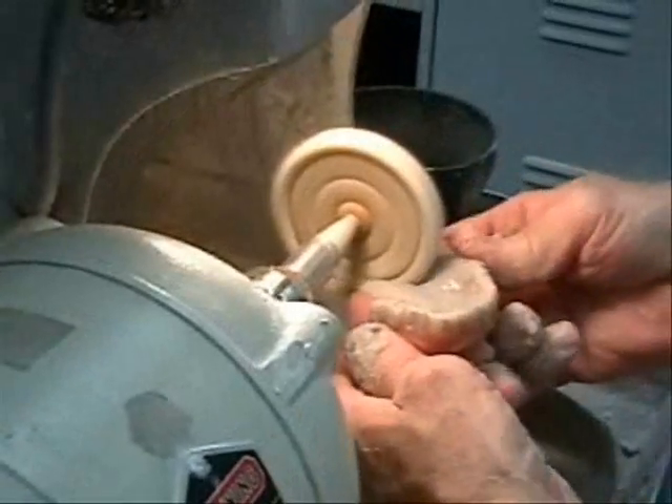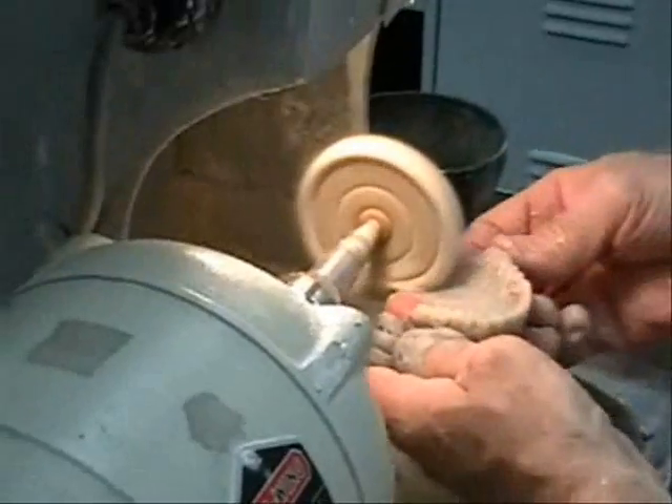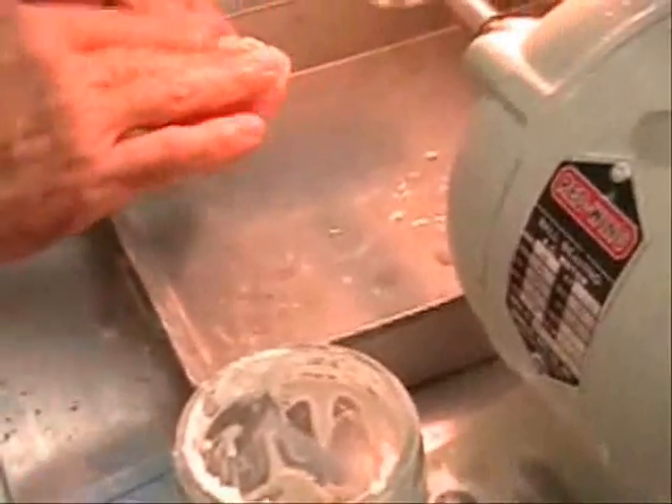The intaglio surface — the surface in contact with the edentulous ridge — remains untouched. Adjustment of the intaglio surface is a clinical procedure accomplished at the time of denture placement.